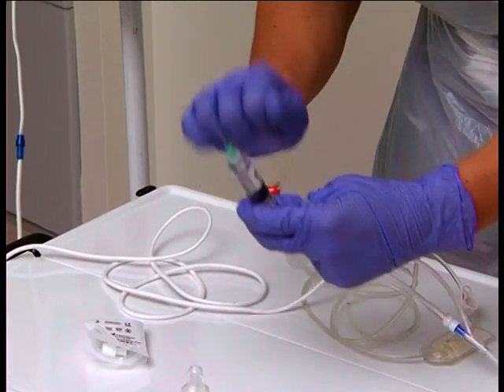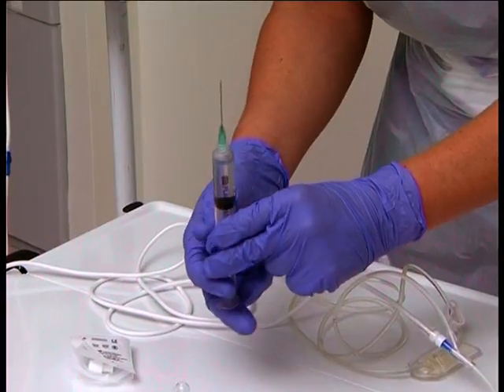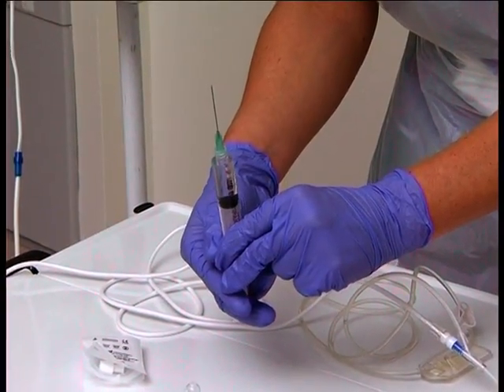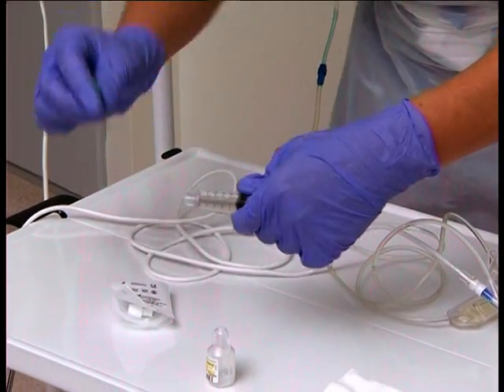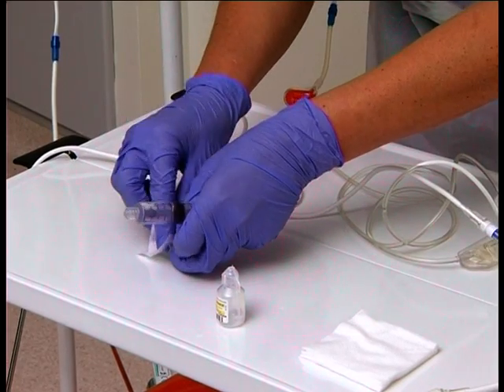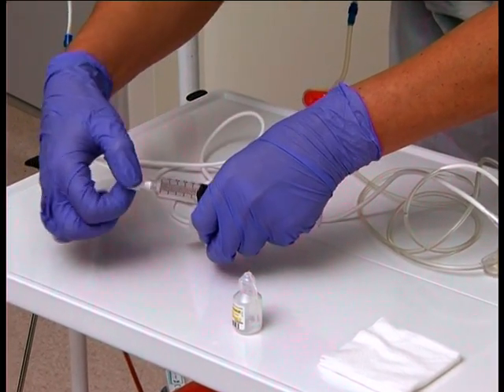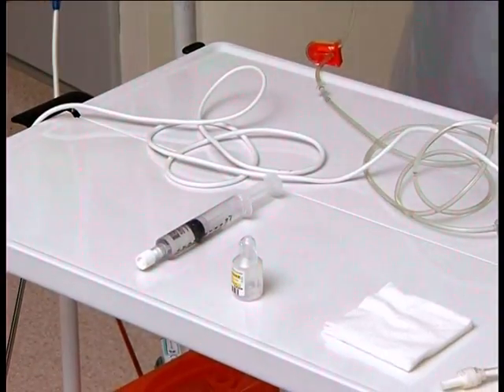Knock the air bubbles to the top of the syringe and then push the plunger to expel the air. Remove the needle and put it in the sharps bin. Take the end cap out of the packaging, taking care not to touch the part that will go onto the syringe. Put the prepared flush down on the trolley. Throw any remaining equipment or packaging that is not needed in the rubbish bag.